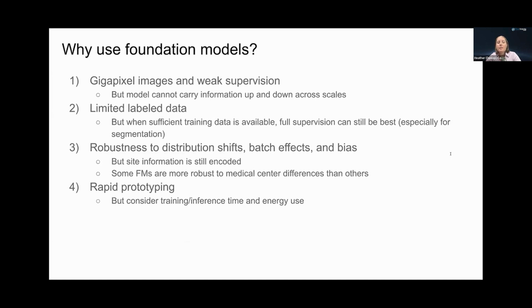We've also seen that foundation models tend to improve the robustness to distribution shifts, batch effects, and bias, but site information is still encoded by all of these models. Some foundation models are more robust to medical center differences than others.